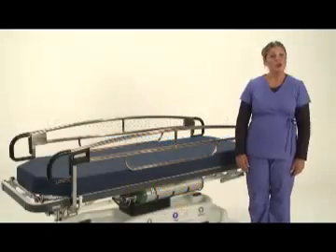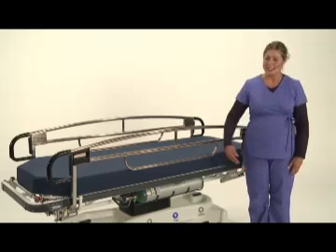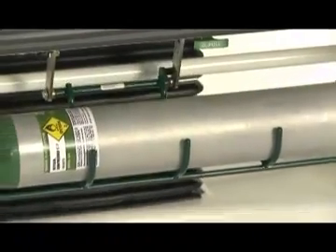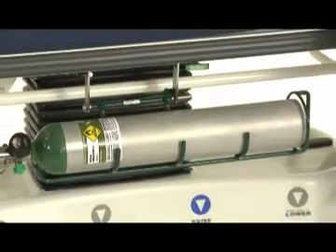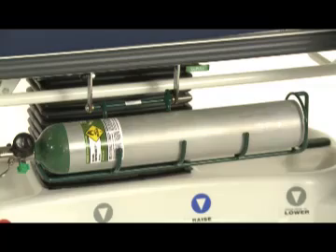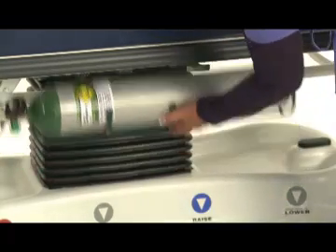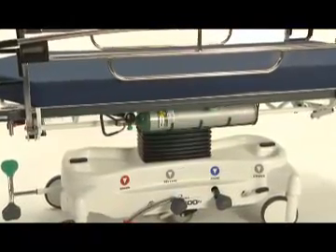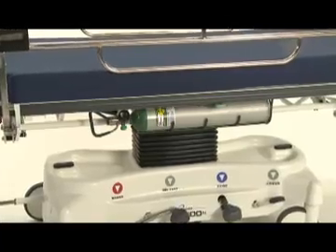Our patented quick-release oxygen tank holder is located at the point of care. Pull on the quick-release lever and the oxygen tank glides downward. Take out and replace the existing tank and return it to its tucked position. Because it's located at the point of care, there's no need to disturb a patient by pulling the stretcher away from the head wall to gain access.